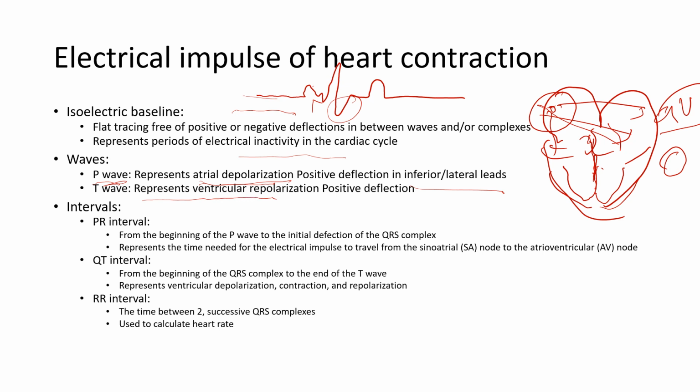The T wave represents the ventricular repolarization. So after everything, when the ventricle starts repolarizing, the T wave will come.